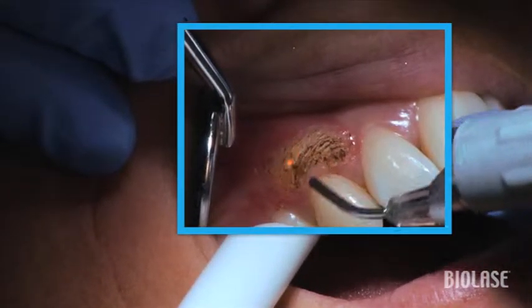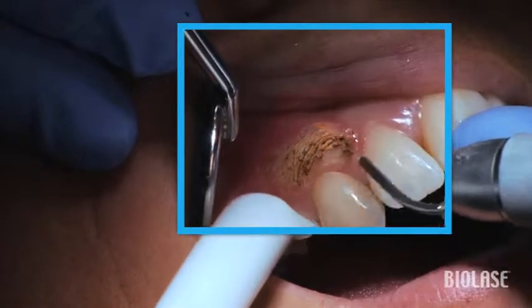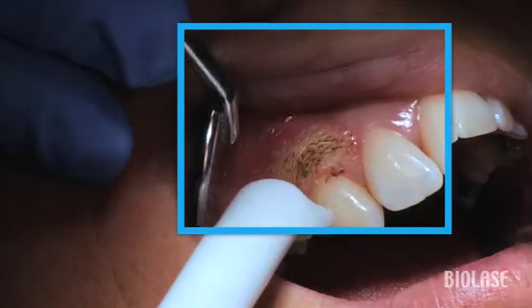Use a light painting stroke to thin out the tissue layer by layer. Blend in the reduction in tissue to the outer borders of the excision site.